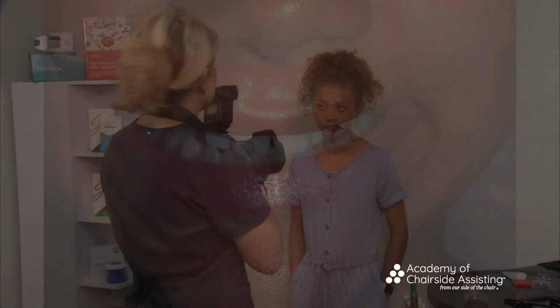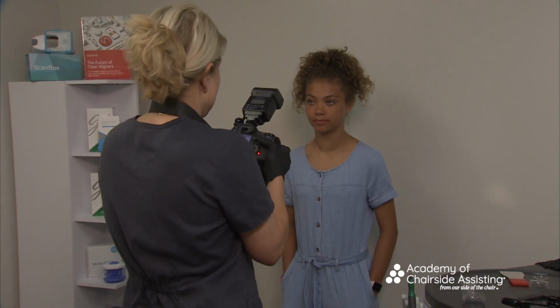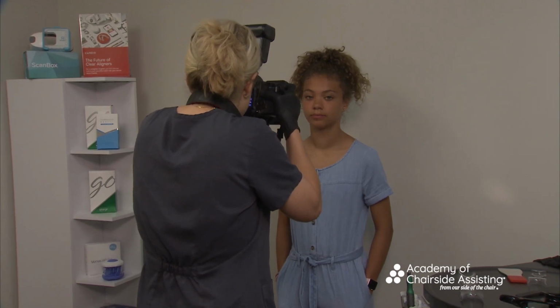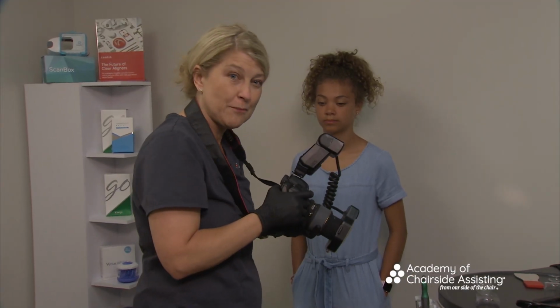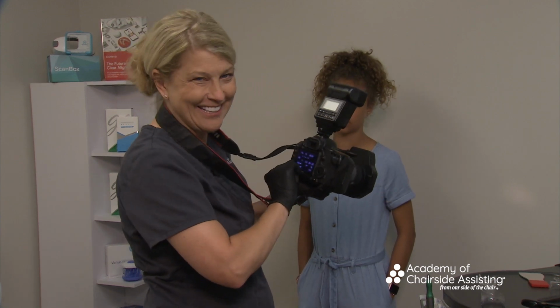Now, Kylie, just your lips together, okay? Chin up. Okay, let's take that one more time, right? Looks great, looks great. We're gonna take one more. Chin up. You heard the encouragement, right? Chin up, looks great. We're gonna take one more. Why? Because I wasn't happy with it.